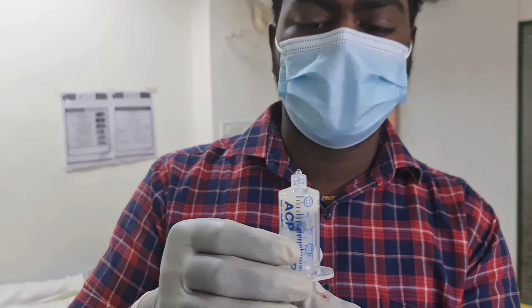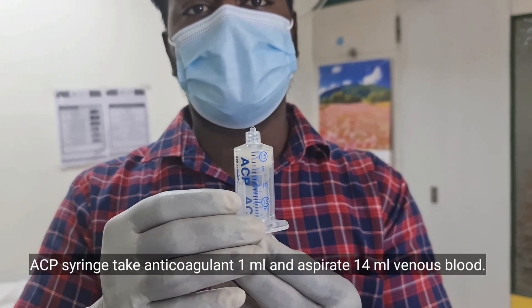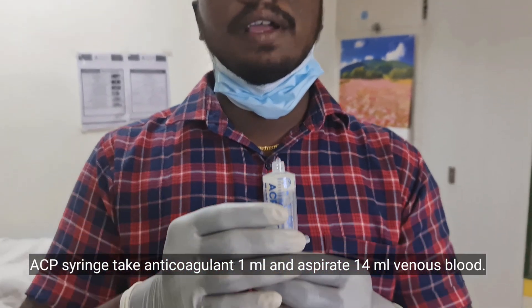Let's see the procedure. This is the ACP double syringe. First, 1 ml ACD solution, then 14 ml blood. ACD is an anti-coagulant solution. Just 5 minutes at 1500 RPM.